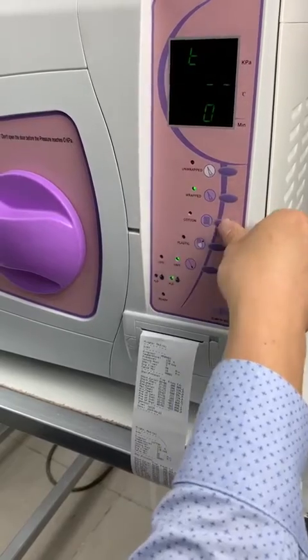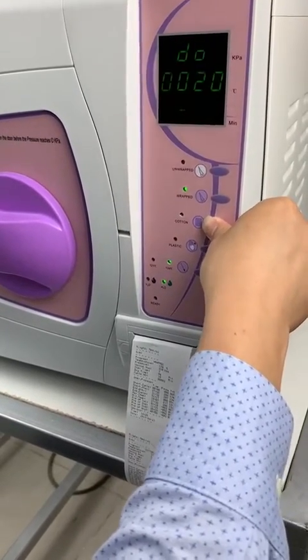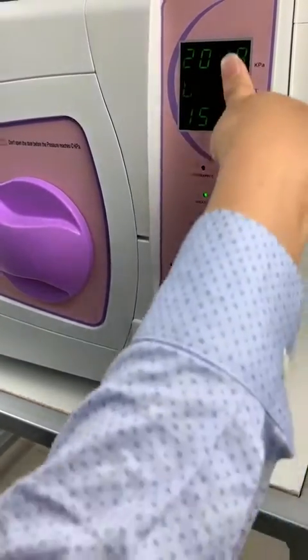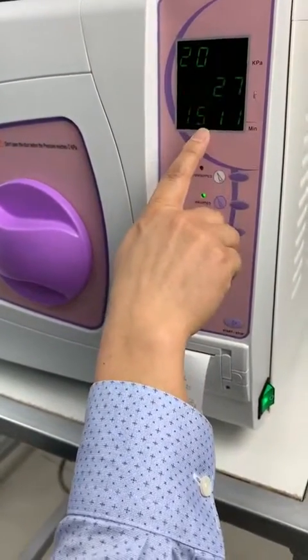Then just press the button until it comes to the time setting interface like this. This is the year, the month, date and the time.